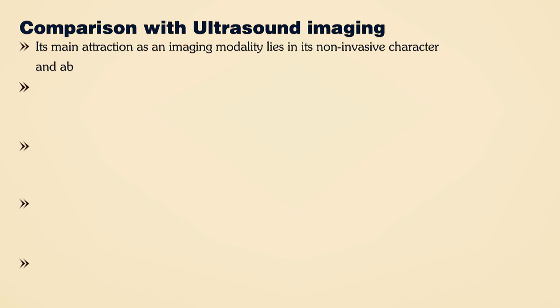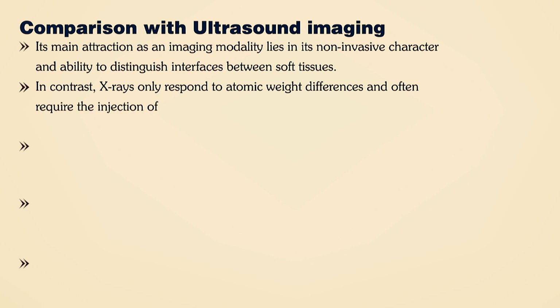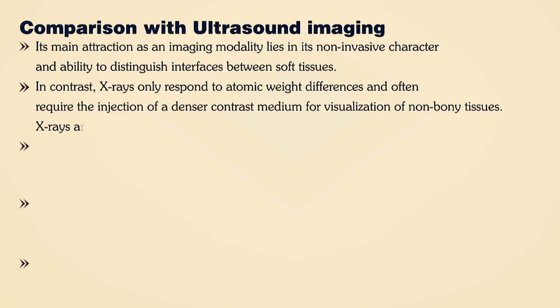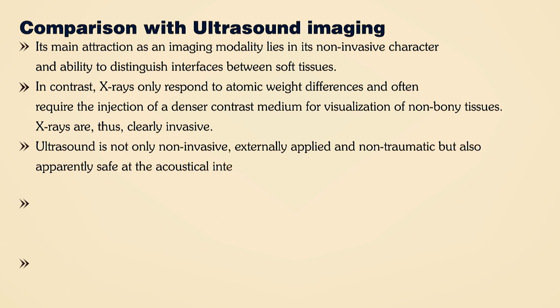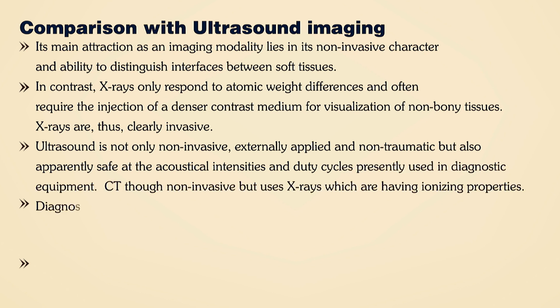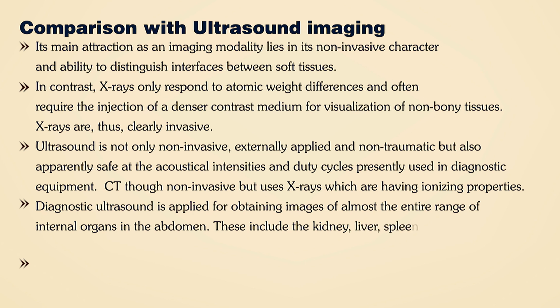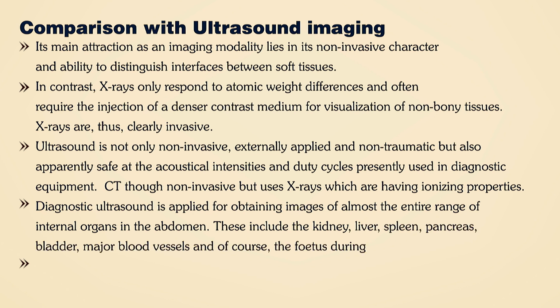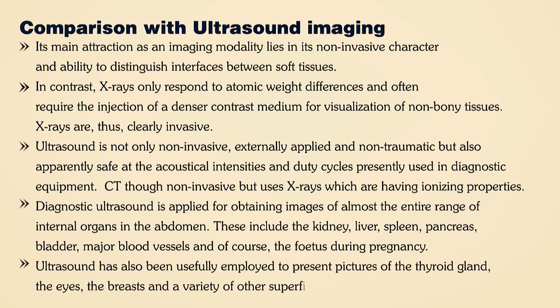Ultrasound's main attraction as an imaging modality lies in its non-invasive character and ability to distinguish interfaces between soft tissues. Ultrasound is not only non-invasive, externally applied and non-traumatic, but also apparently safe at the acoustical intensities and duty cycles presently used in diagnostic equipment. CT, though non-invasive, uses X-rays which have ionizing properties.